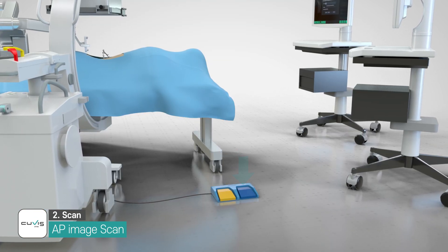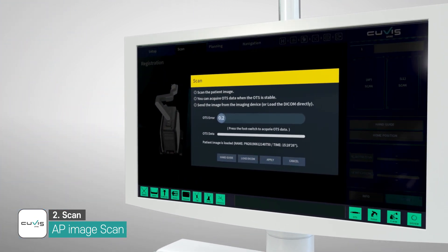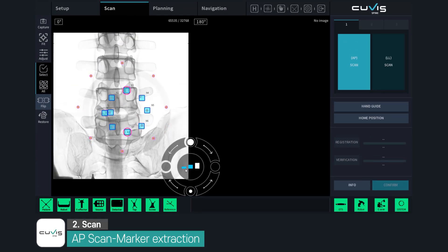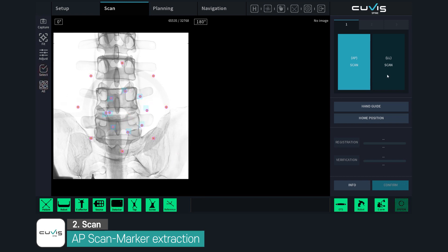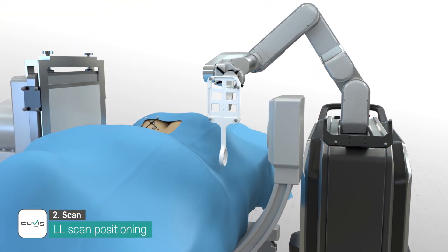After C-Arm scan, the image is transmitted to the system. The marker tracking data is also recorded. Registration is completed when all radiopaque markers are extracted in the AP and lateral images. If the ROI contains each marker in the image, the marker extraction is automatically processed.